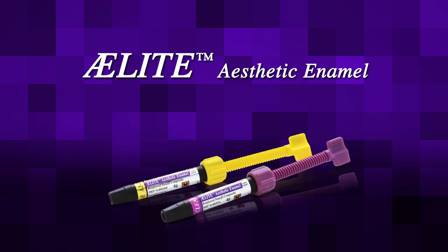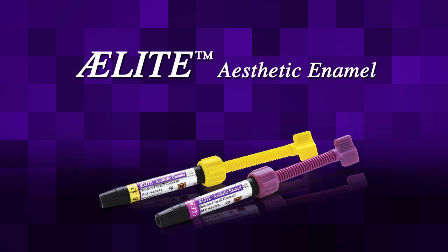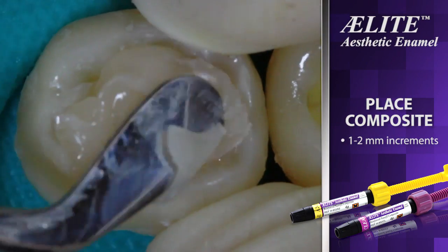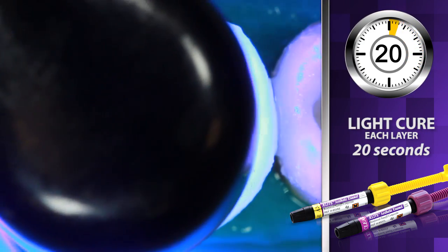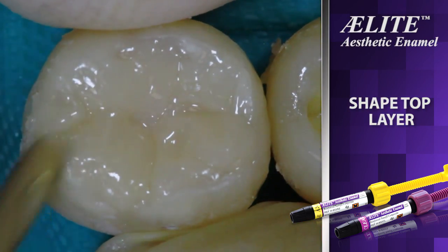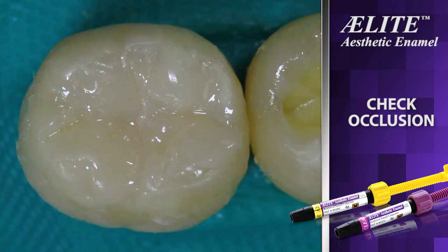Elite Aesthetic Enamel Reinforced Nanofill Composite is selected to restore the enamel. With this material, the clinician can create strong, durable restorations that polish to a high luster finish. Place 1 to 2 mm increments of Elite Aesthetic Enamel Composite and light cure for 20 seconds. Light cure the final increment for 30 seconds, then check occlusion and finish.